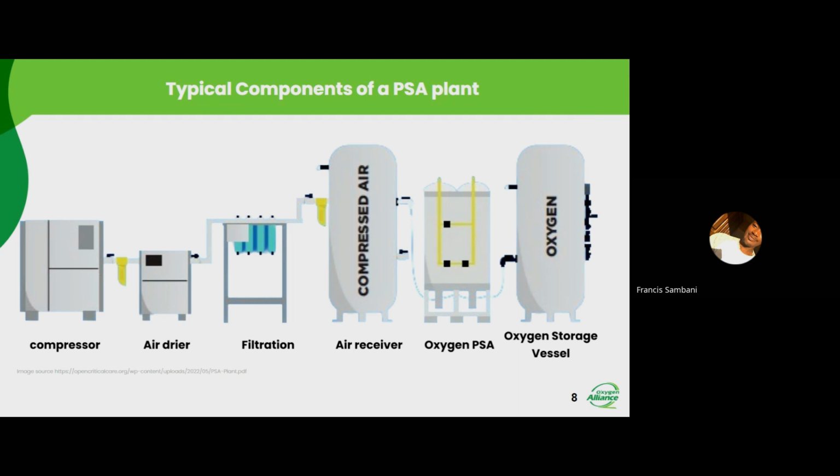But in our case, we also had 2 minor leaks, but after solving the leaks, they didn't help to raise the purity. In other cases, an air leak or an oxygen leak would cause the purity to go down. In our case, it was the valves. We can't really say which valves, because we ended up changing all valves, like the equalization valves, as I said. So that solved our problem.